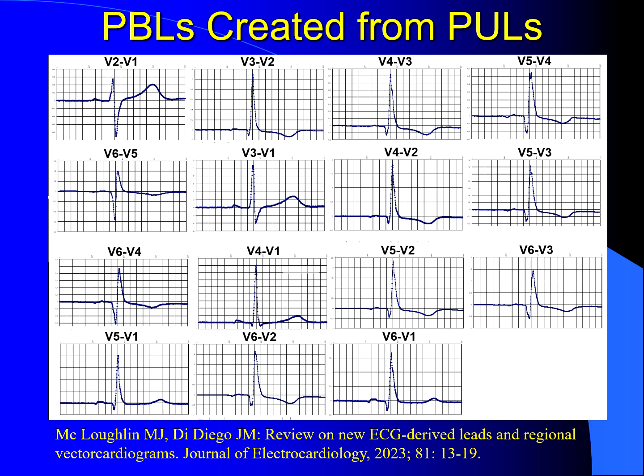Panel C presents the 15 PBLs that can be obtained from the electrocardiogram of panel A.